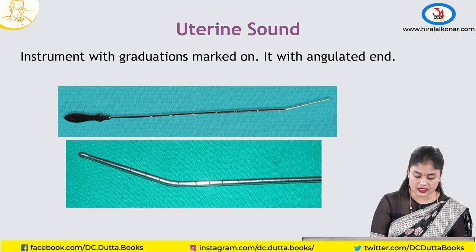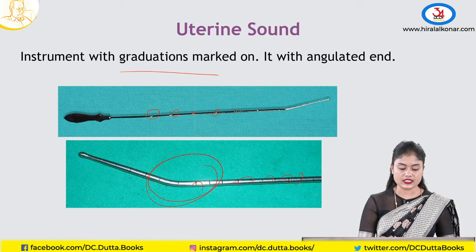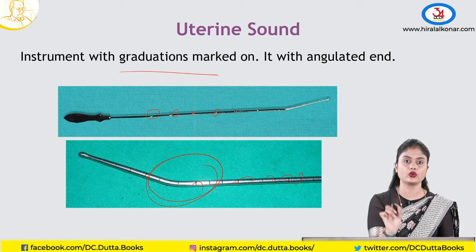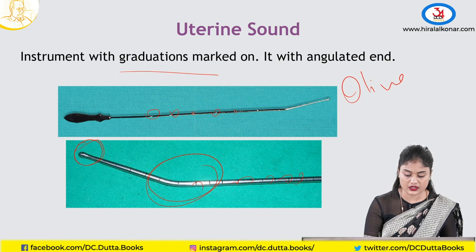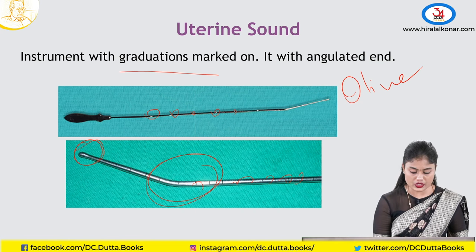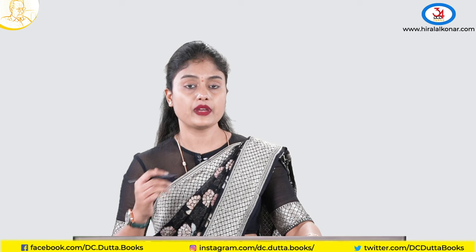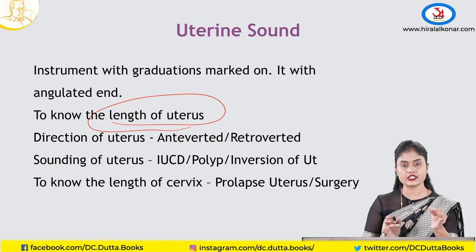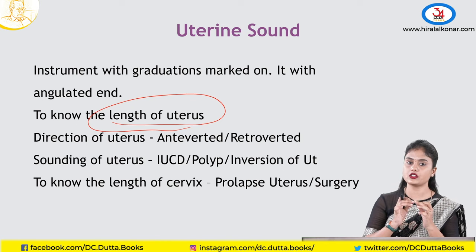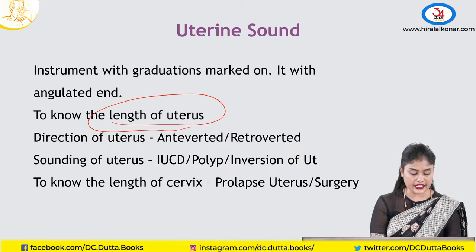Coming to the uterine sound. You can see graduation markings on the instrument with an angulated tip — it is called an olive-tipped uterine sound. It is the thinnest instrument that can go inside the uterine cavity without causing harm. It is used to measure the cervical and uterine length — from the external os to the internal os is the cervical length, and from internal os to the fundus is the uterine length. The direction of the uterus can also be known by the angle of the sound.